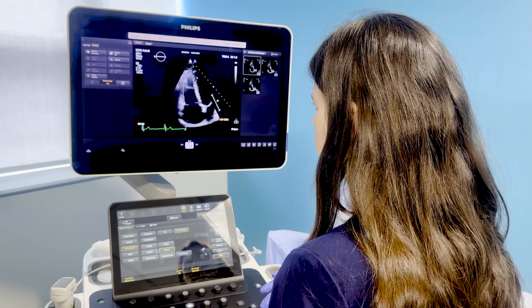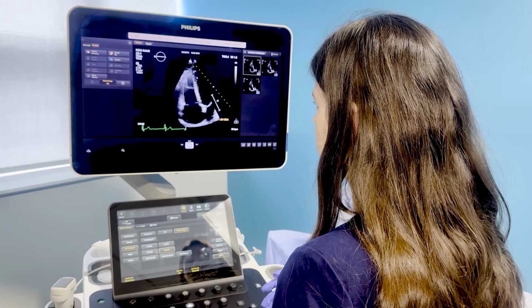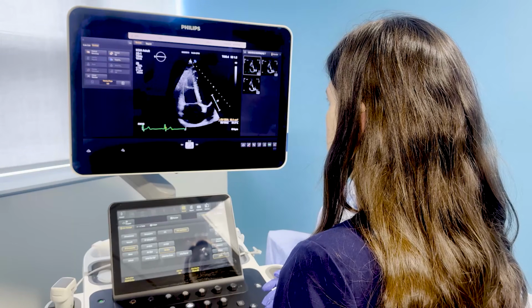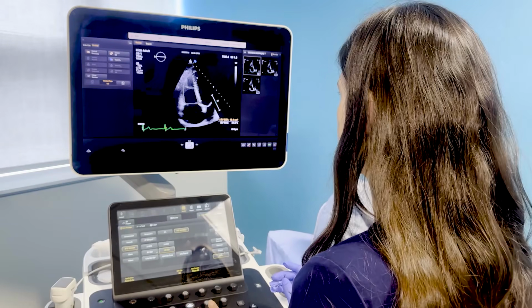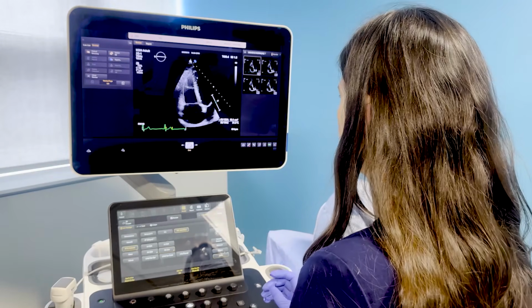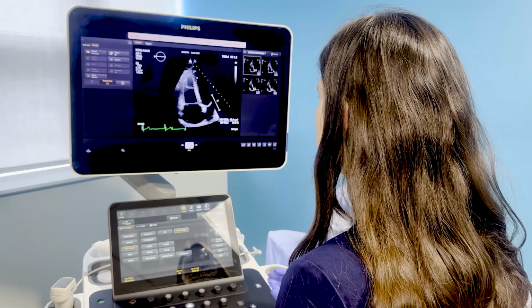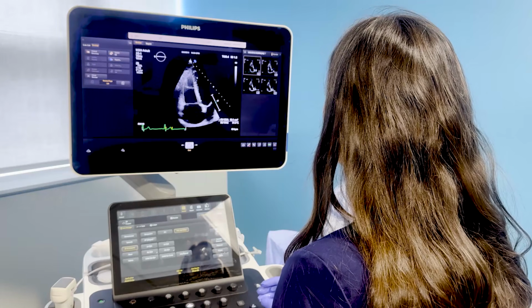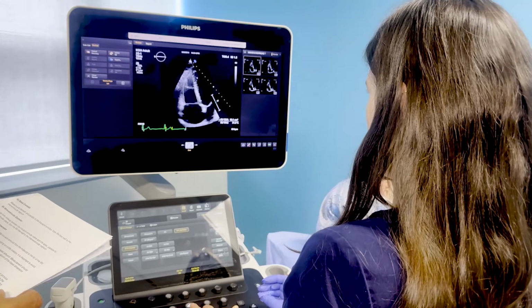In our lab, we often do our measurements offline on the computer, and then the echocardiographers can adjust the measurements as they see fit. Right. You have more control of the cursor that way, right? Yeah. But it looks like this package gives us a fractional area change as well. Okay, great. So you may have a fractional area change measurement in your package.